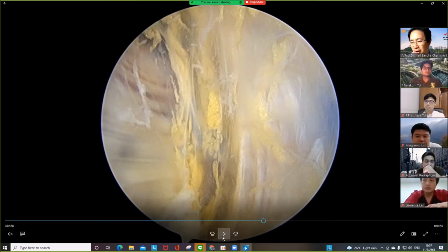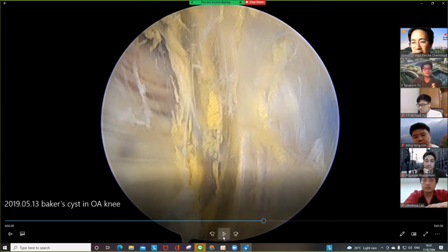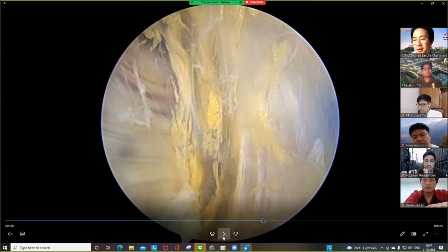I remove the valve and also I open the valve to make it in and out easy, not a one-way valve, right? And also I compared with my result using the valve dissection together with the cyst wall removal. My result of the cyst wall removal is better. Okay. So I'm not sure about that, it is personal experience. We didn't have the comparative study yet. With the good result, it means that there is no recurrence. Recurrence, yes, no recurrence. Thank you, sir.